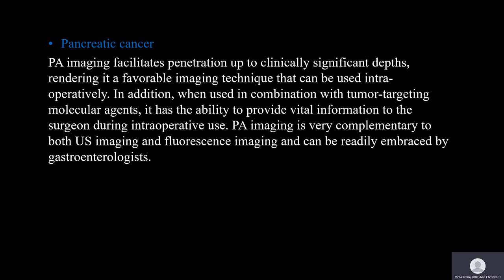And we can use it as well in pancreatic cancer. As we know, this imaging facilitates penetration to a clinically significant depth, providing a good imaging technique that can be used intraoperatively. Using the high penetration depth of photoacoustic imaging, it can be used intraoperatively to give the surgeon important information about the pancreas, any changes in the pancreas, which can change the decision of the surgeon intraoperatively.